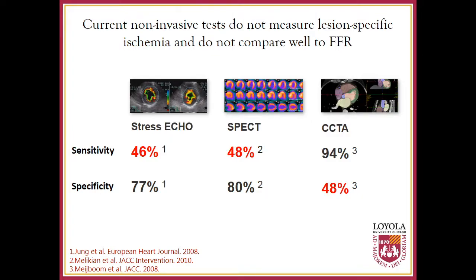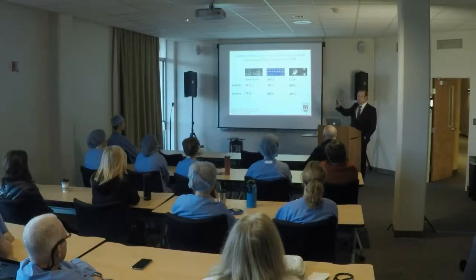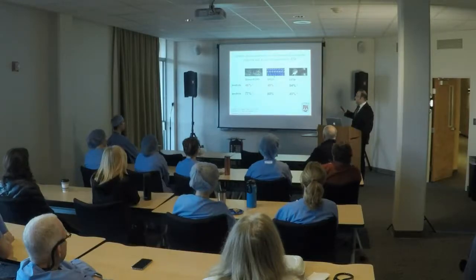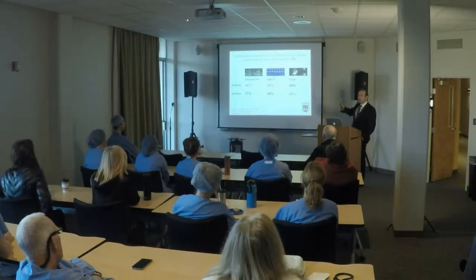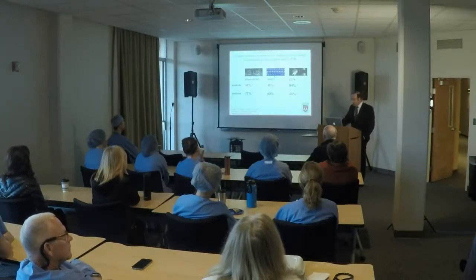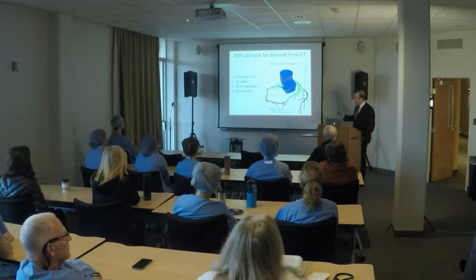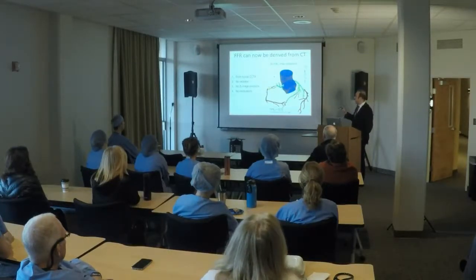Although the sensitivity is very high, we don't miss disease with CTA alone. The specificity is quite low, so the positive predictive value is also quite low when comparing CTA to invasive FFR as a reference standard. So ideally, you'd have a test that's non-invasive that has the sensitivity of CTA with a higher specificity in diagnosing lesion-specific ischemia. And now FFR can be derived from a static standard coronary CT angiogram.